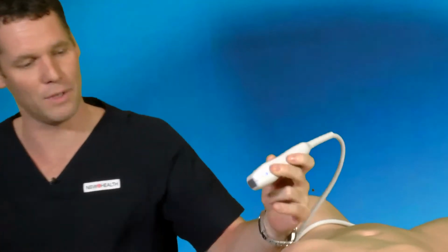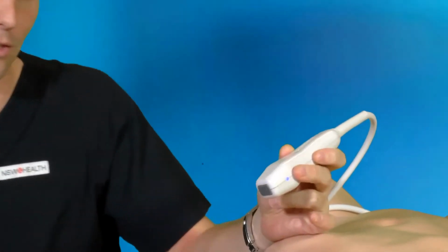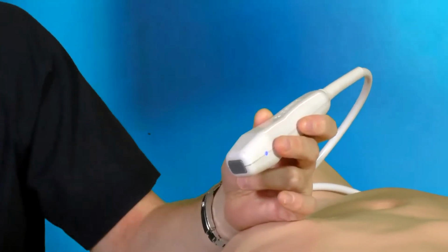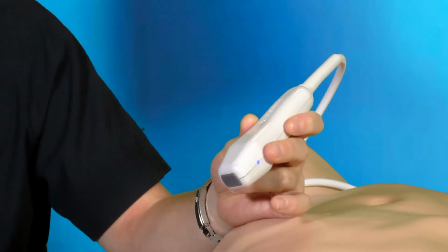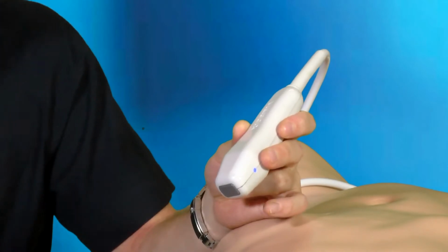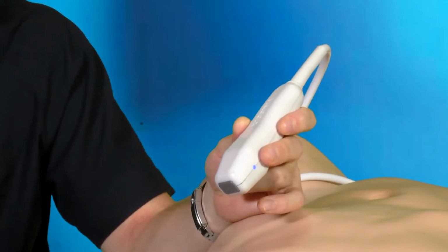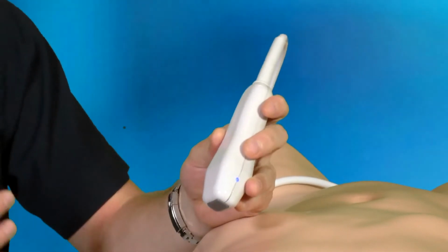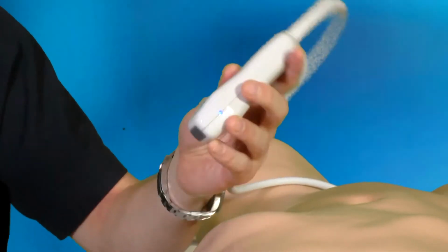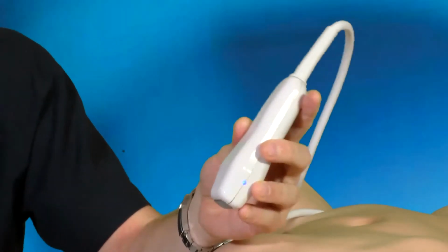So let's talk about how to do the actual imaging. First of all, it's how you hold the probe, and I encourage you to hold it like a pencil. I image from the left side of the patient, and that's because in the critically ill, you've often got lots and lots of tubes, they're intubated, and there are ECG cables and ventilator tubing, and often people trying to do things from the other side of the bed. So I image from the left side of the patient so that we can keep out of the way of everything that's going on. So you can image almost at the same time as resuscitation, if you like.